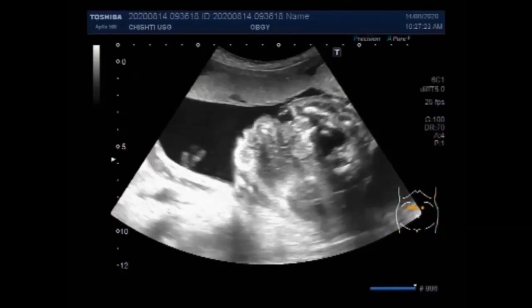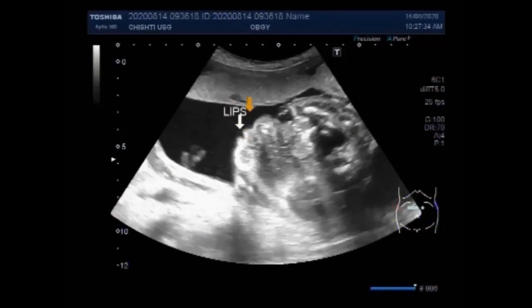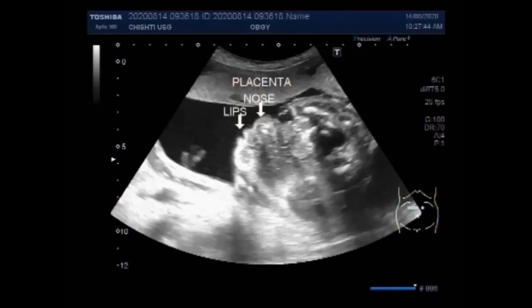Now you can see the face of the patient — these are the lips. This is the face of the fetus. In some cases, it may be associated with polyhydramnios and placental edema. Polyhydramnios is seen in this case. This is the placenta. You can see the nose, eyes, and lips of the fetus.